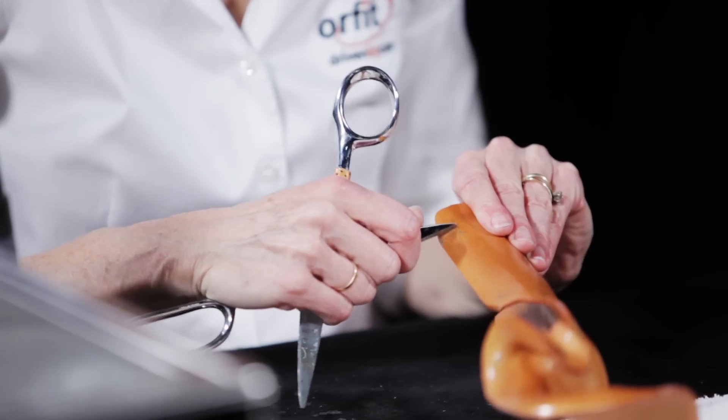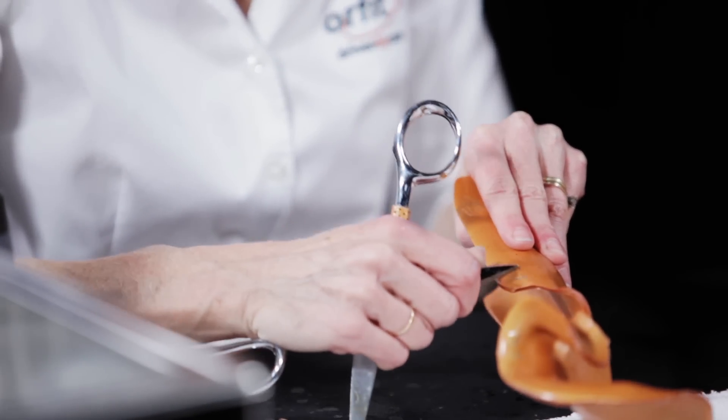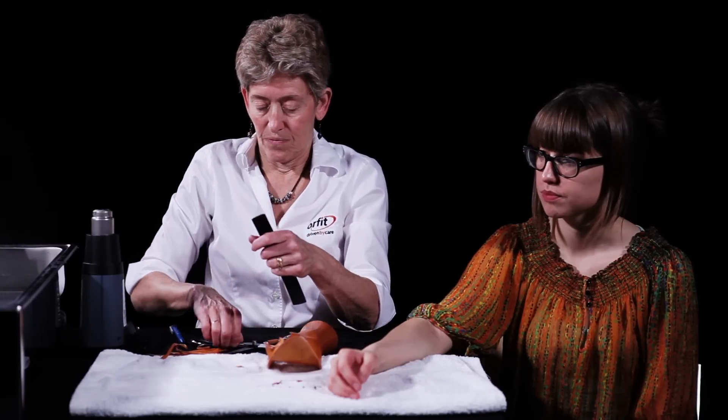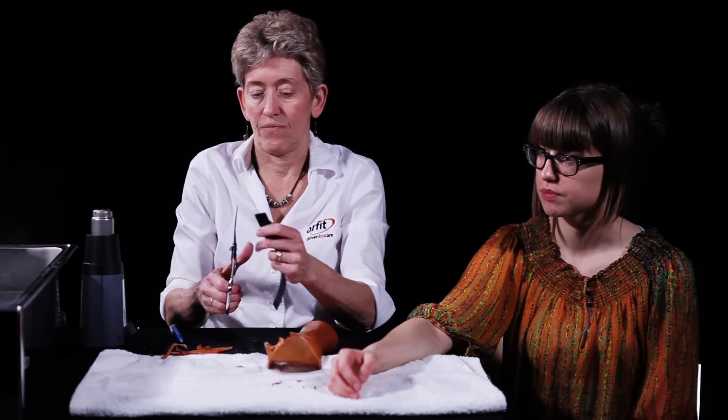Velcro loop straps can be attached directly to the thermoplastic material. Orfit Colors NS has a coating which must first be removed by scraping with scissors. Prepare the Velcro loop straps.